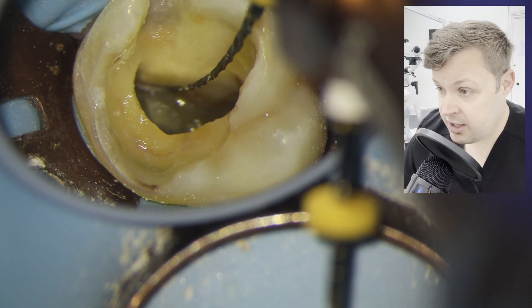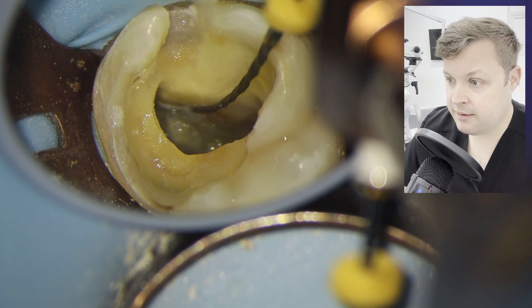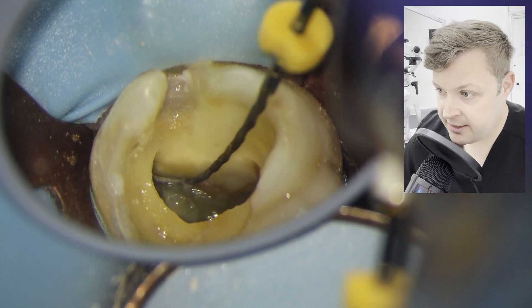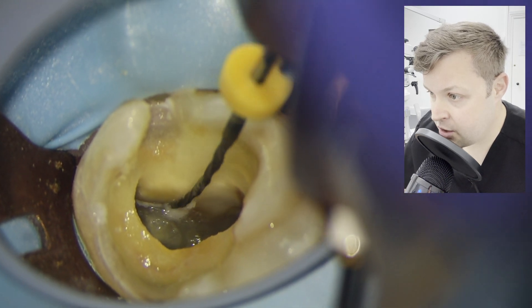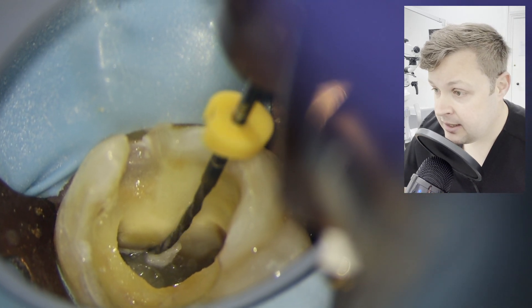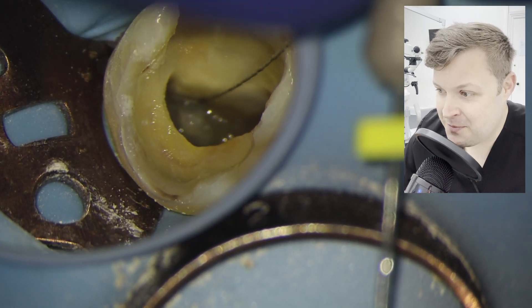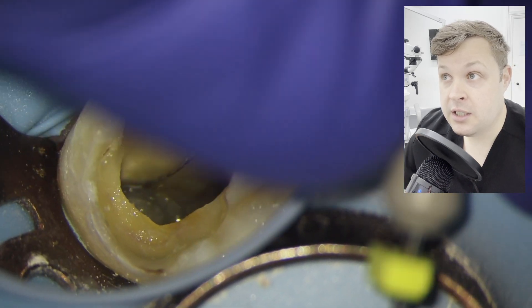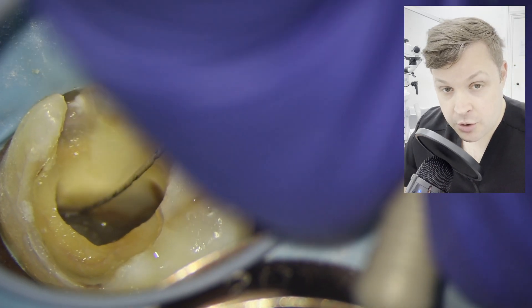Back in with the size 15 — the HyFlex 1503 — and now it's starting to really go to length, because I've opened up this orifice. I'm just letting the file do its own thing. I haven't taken a working length x-ray or working length measurement with my apex locator yet — I'm just going about one third of the way of the MB1 working length. Now I'm going to use something called a D-finder. These D-finders are absolutely amazing, and if you are struggling to get to length on canals, I strongly suggest you get yourself some. I don't know how they work — they just work. They're magical.